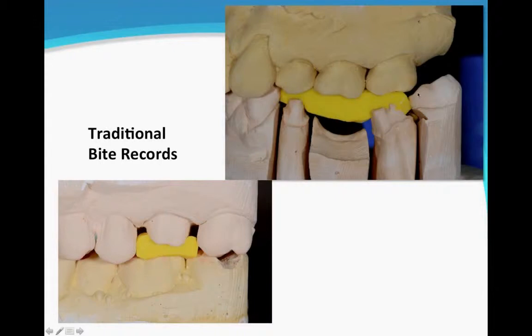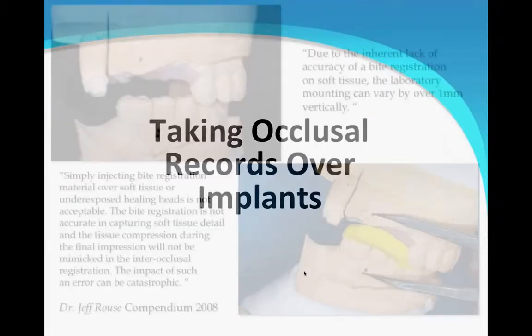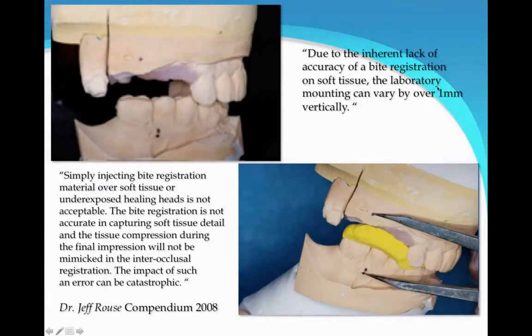No brainer. A case like this, if you had to hand do it, you probably would have followed this where the bite's been open since. Single units, exactly the same thing. We loved it. It works. And we just keep right on using it until all of a sudden we have implants. Well, what happened when we had implants? Because the preparations disappeared, didn't they?